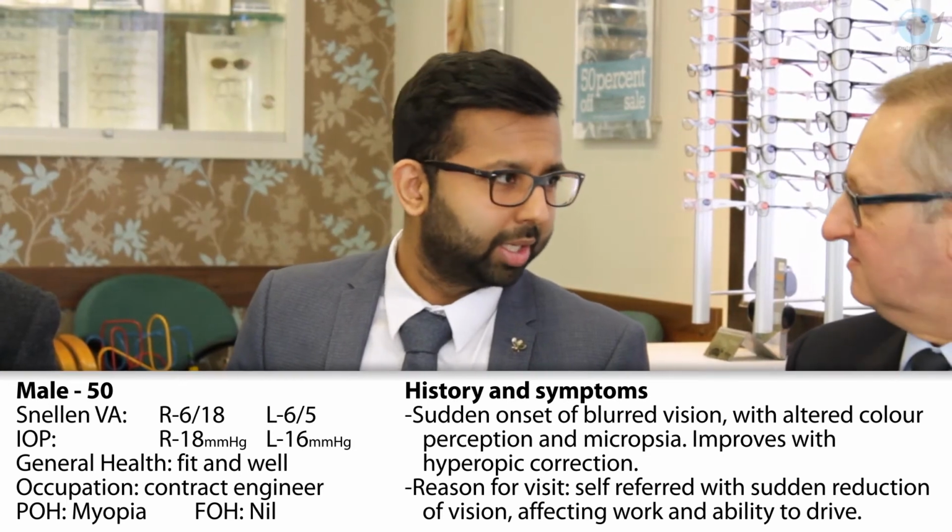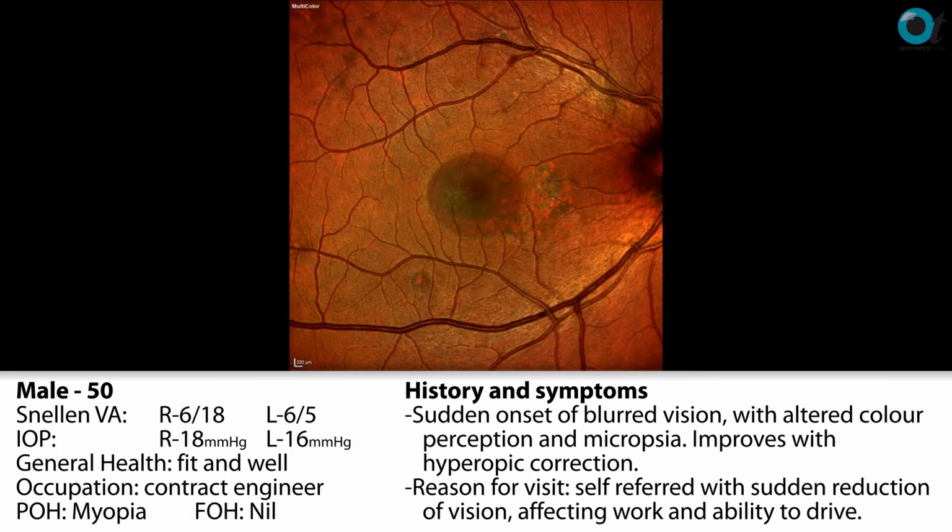It could be wet macular degeneration as well, couldn't it? On the actual fundus picture, the pigment's uneven. Just slightly to the right of the obvious grey lesion, there's quite uneven pigmentation, which could be significant as well. Okay, what do you think that could be then? Well, I would have assumed that the retinal pigment epithelium is just uneven or disrupted.